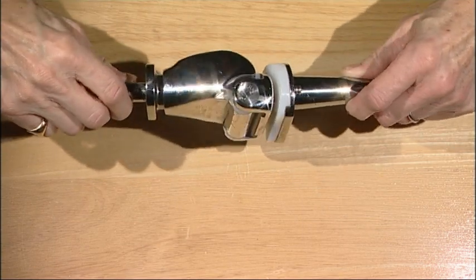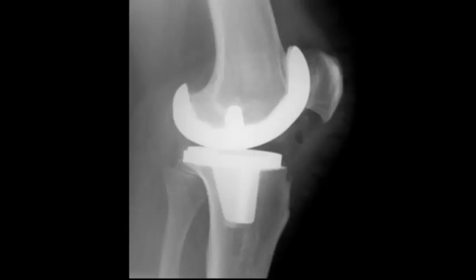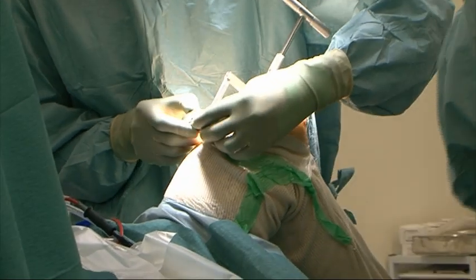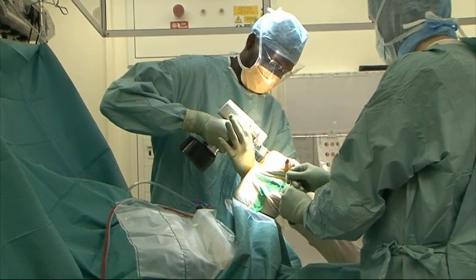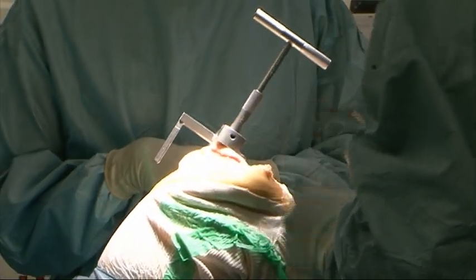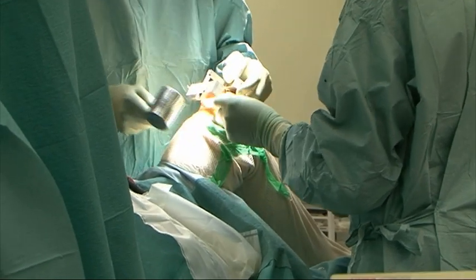The implant companies have created families of implants from unicompartmental through cruciate sparing, posterior stabilized, super-stabilized, to fully constrained prostheses. Often using the same instrumentation, this allows flexibility if there are intraoperative complications and reduces the amount of storage space. Instrumentation, size ranges, materials, quality control, distribution, education and research have all expanded to create the choice available today.